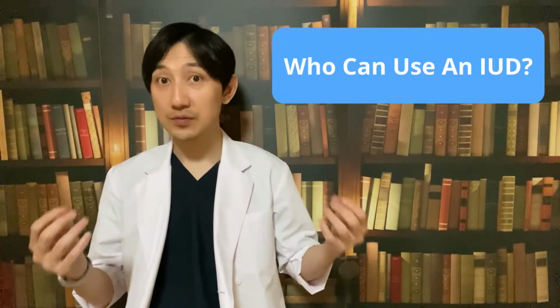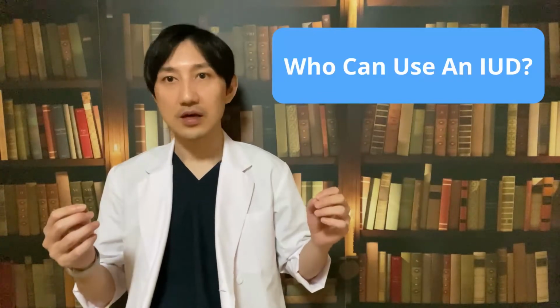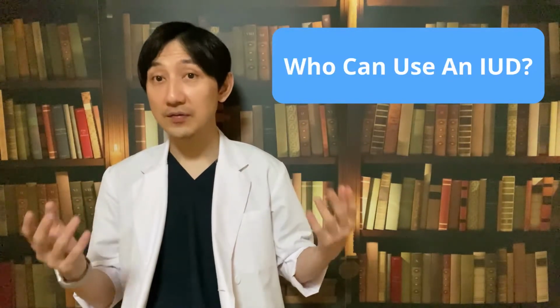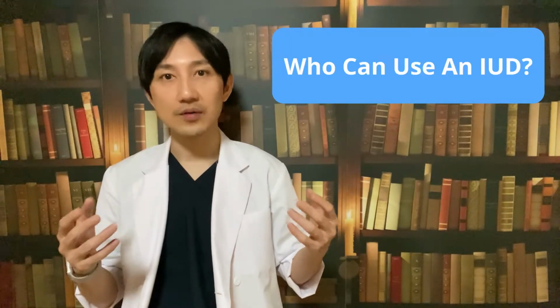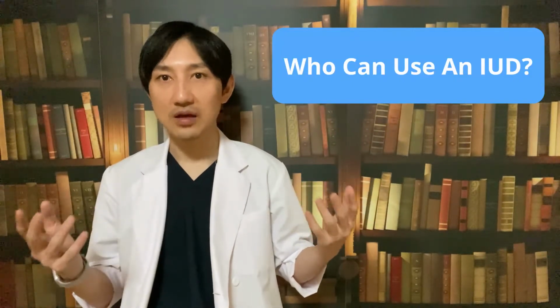If you are breastfeeding, having an IUD fitted won't affect your milk. However, you should not use one if there is a possibility you are already pregnant or if you have an untreated STI or pelvic infection. Signs of a possible infection are pain in your lower abdomen, a high temperature, and a smelly vaginal discharge, and you should see your doctor if you have any of these.